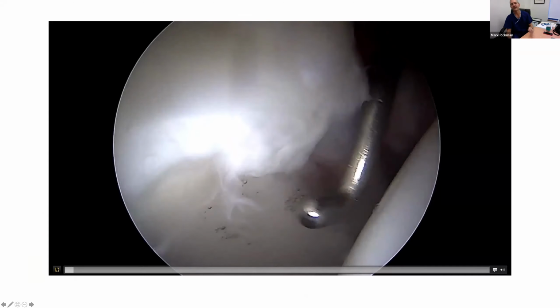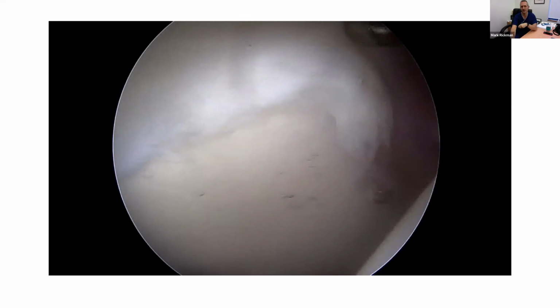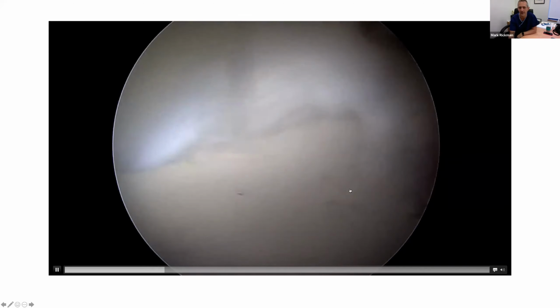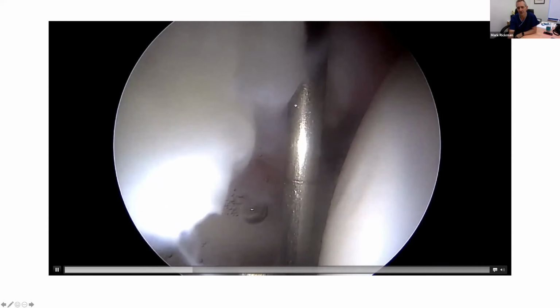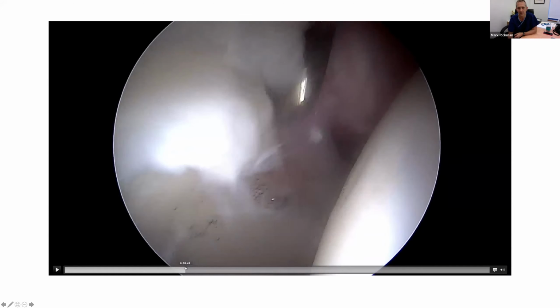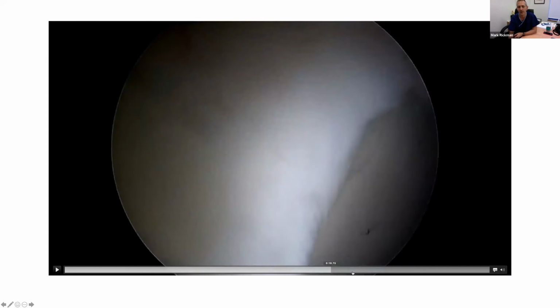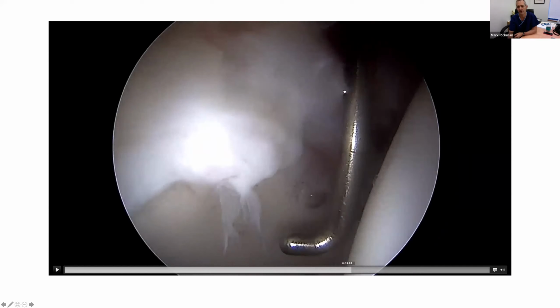All right, and then just before we get on to a case or two, this is just a typical hip arthroscopy. That's the labral tear hanging down into the joint, and you can actually see the junction here between the torn labrum and this chondral surface that's damaged. This is not all labrum. When it comes back round, you can see the labrum coming around here, and then the articular cartilage.